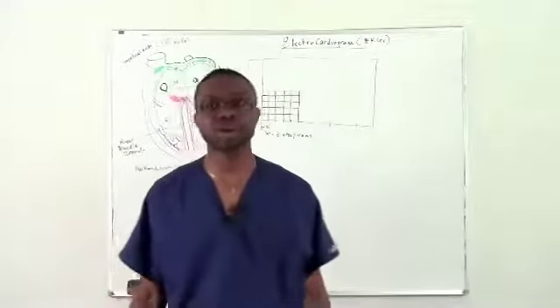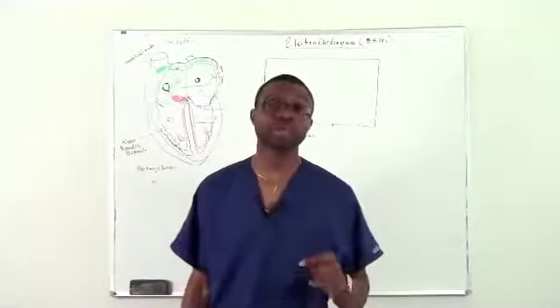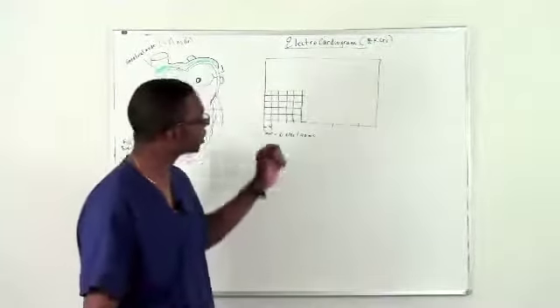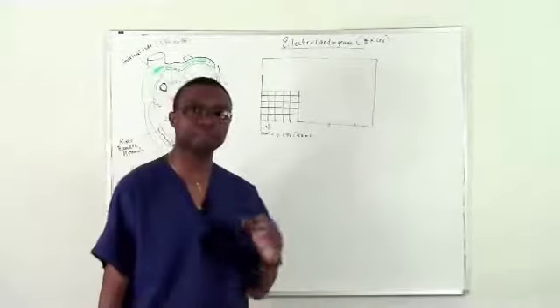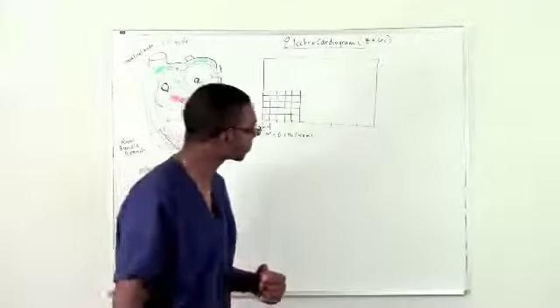So what is an electrocardiogram? Electrocardiograms, also known as EKGs, have some basic features, which I'm just going to talk about on the board here, before we move on to the cardiac electrophysiologic system.